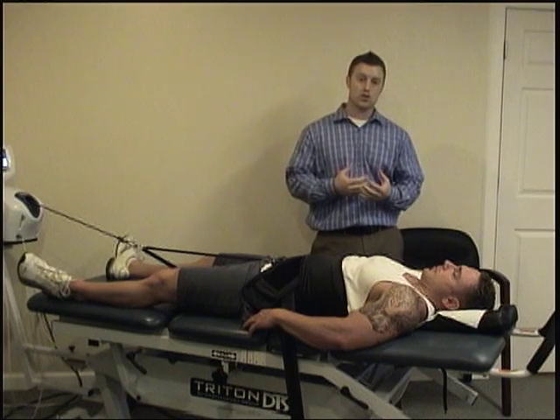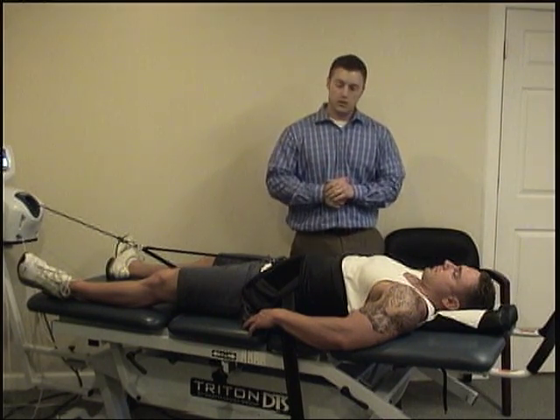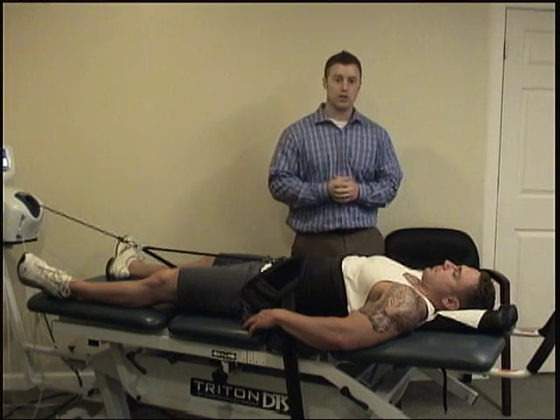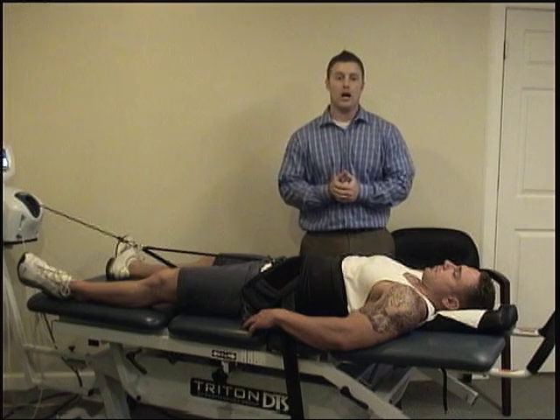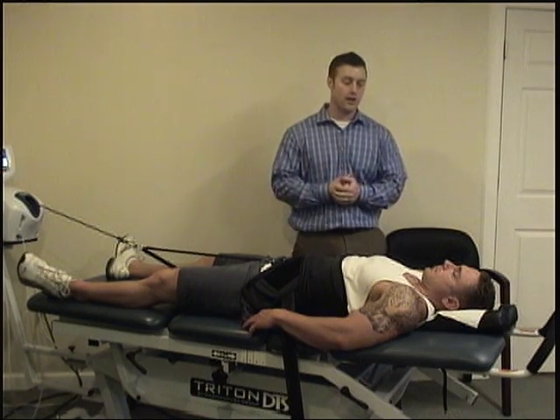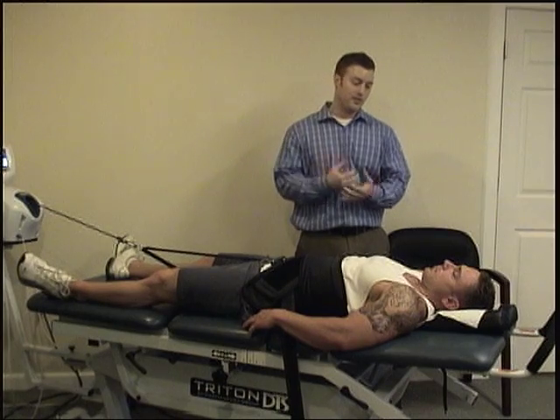So what this spinal decompression is going to do is help to rehydrate and repair some of the damage that has been done to the spine, not only from weightlifting, but also from sitting.